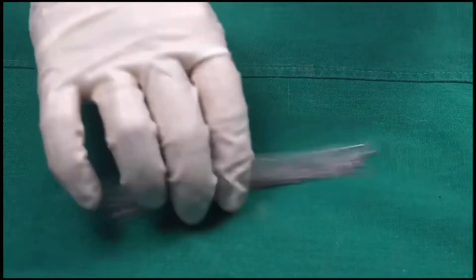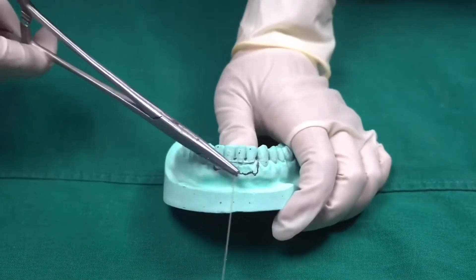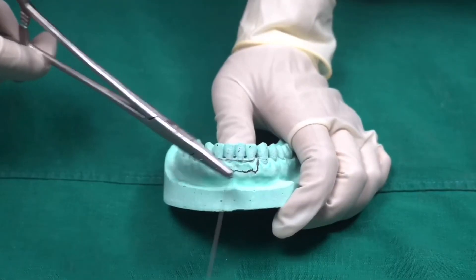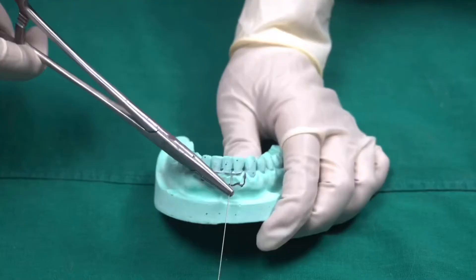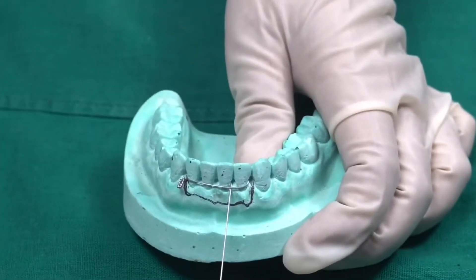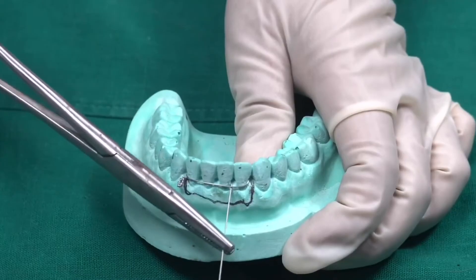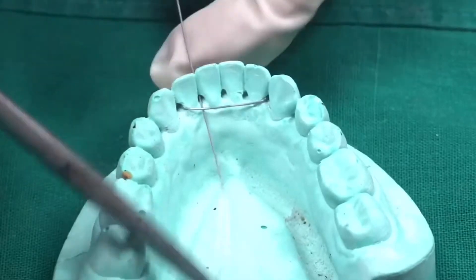Take some additional wires and insert them into the buccal and lingual wires. Take a single wire and insert it into the interdental region in all the teeth in between the fracture line. Pass a wire from below the buccal wire — you can see in the video — and then pass it towards the lingual side.